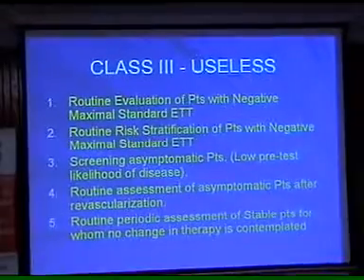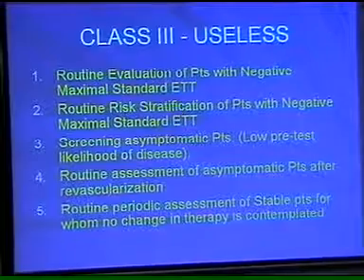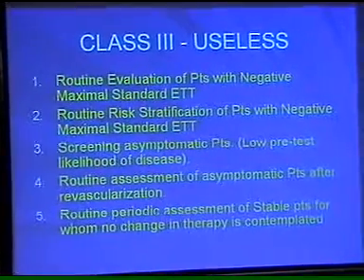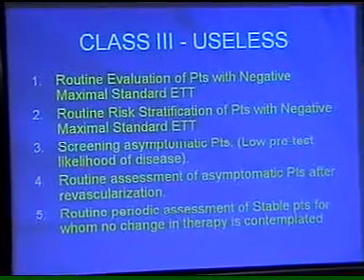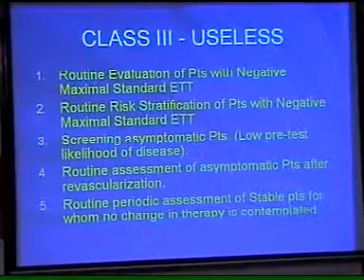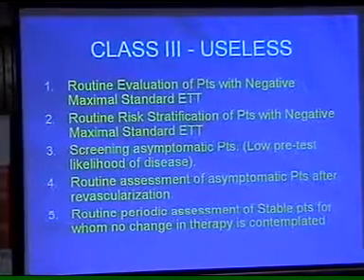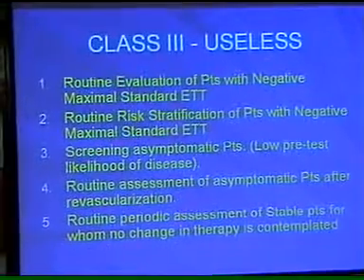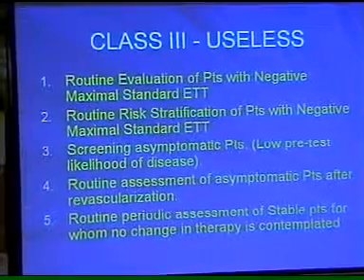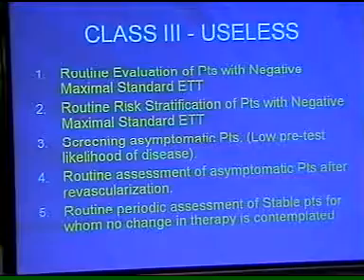And class 3 is useless in cases of routine evaluation of patients, because this is not a test to be used routinely, or in patients where there is low probability of the disease. Routine risk stratification, screening asymptomatic patients. I mean, this is abuse of technology. Routine assessment of asymptomatic patients after revascularization. Routine periodic assessment of stable patients for whom no change in therapy is contemplated.